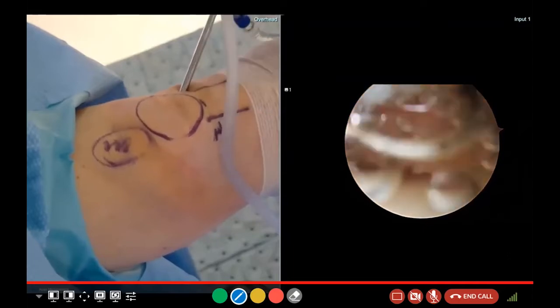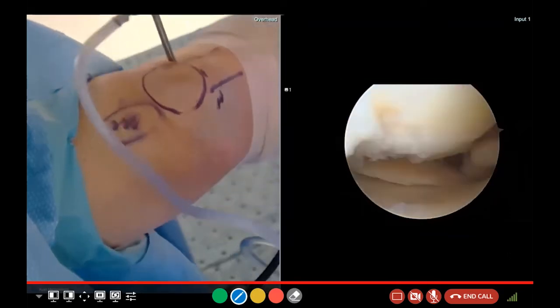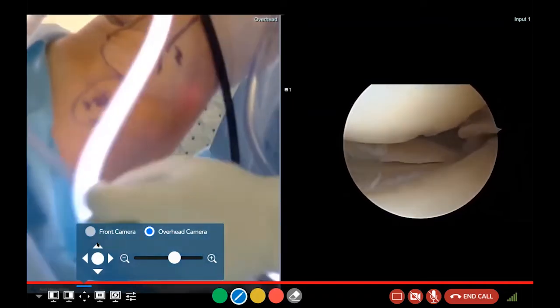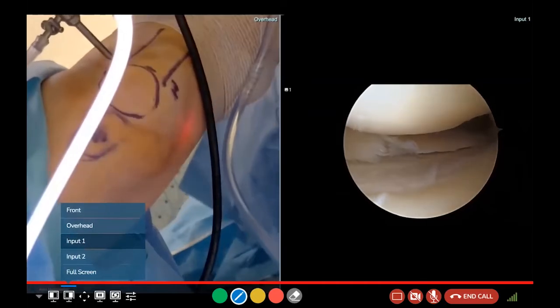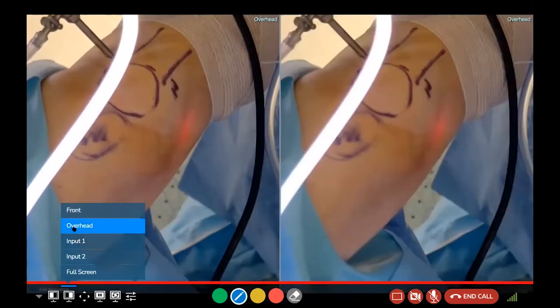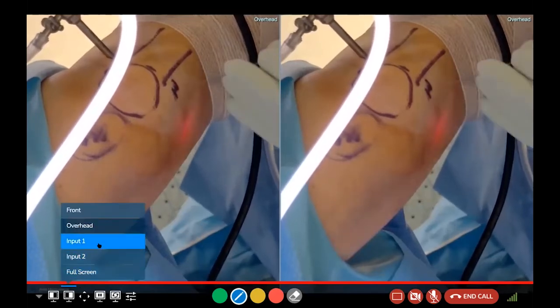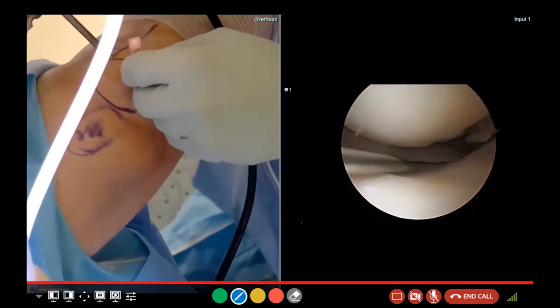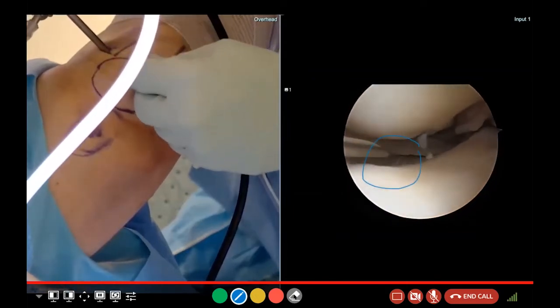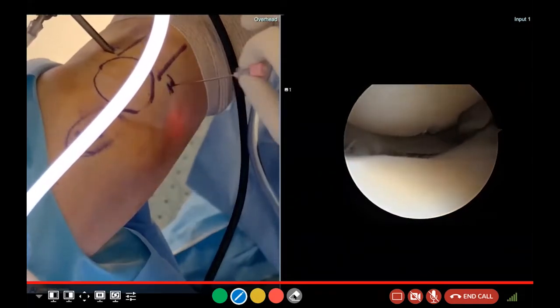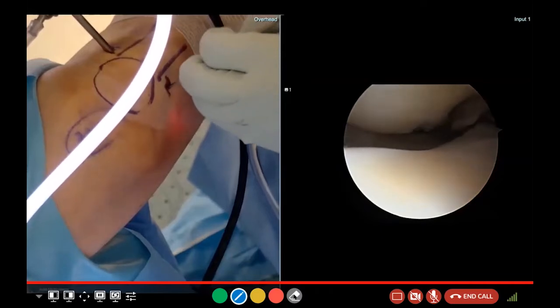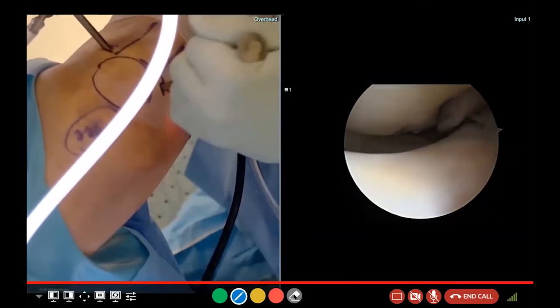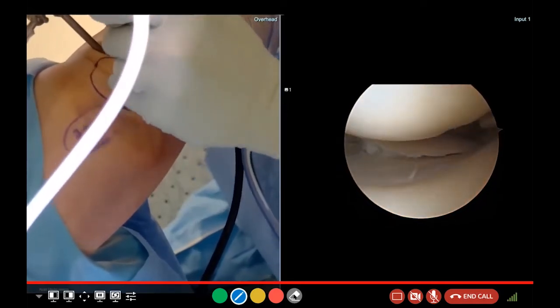I turned off the water — had my suction turned on. Rookie mistake. Now we're inside the medial aspect of the joint. I'm going to open another portal. Here's my needle and I'm going to create this other portal. You can see my needle now inside the knee. I want to get the right trajectory to make sure I can reach that meniscus. I'll pull out the needle and make another incision here. A mentor once said if you go through the vein on the medial side, it must be the perfect portal. This is the trocar just opening up that hole to make sure I have access.